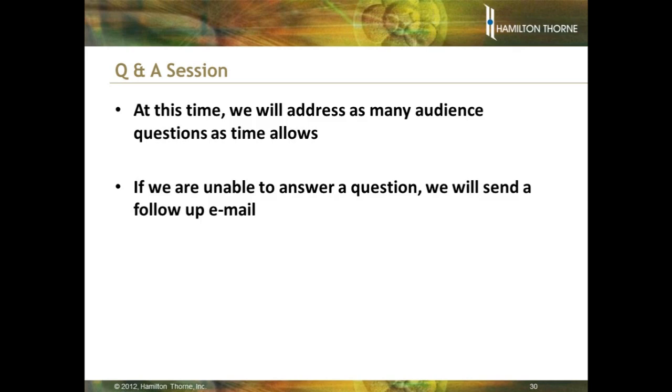But I don't know, Dermot, you can chime in here. I don't believe you're exactly correct, actually, Barry, because the region that you're heating is so tiny compared to the droplet size that it's like being in the ocean. So the heat will rapidly get dissipated in the whole thing, and you won't see any change. So I don't believe there's any change in the drop temperature regardless of the size of the drop, as long as it's big enough to fit the embryo. That's correct. A very, very slight increase, which is negligible.